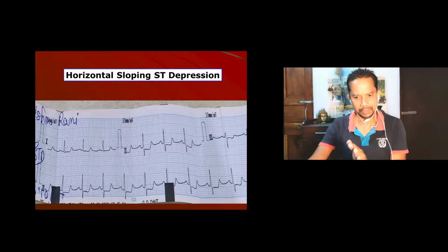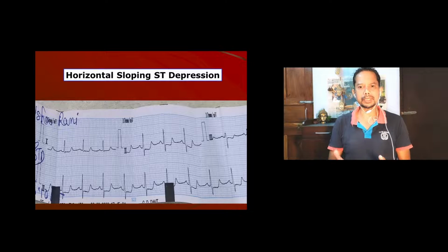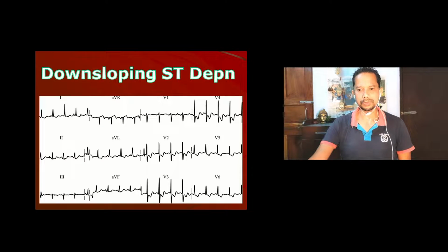And then while you're looking at the MI, you look at the P wave also. Today we will be discussing atrial MIs also, because it's very important. Most of the time we don't even think of atrial MI, and we just say troponin is positive. No, this is not MI, this is probably a wrong report. But you look at the P wave amplitudes and the distal limb of the PTa segment, we'll come to that, and you might see an MI in the atrium, atrial MI. And many times atrial MI will present with atrial fibrillation, atrial flutter, and other atrial rhythms, atrial ectopics, and once those things settle down, you might see an atrial MI. We'll come to the slide soon.